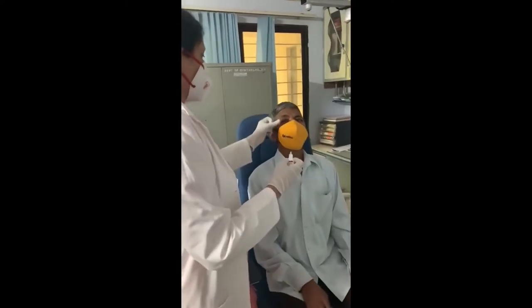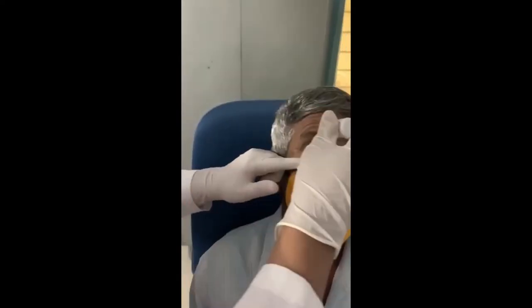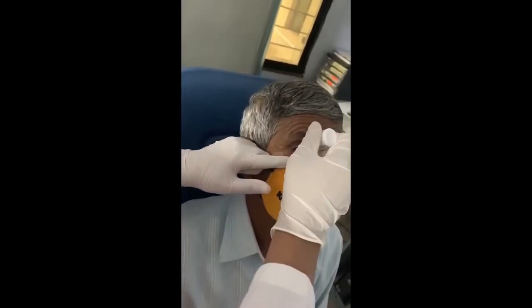After explaining the procedure to the patient, two drops of proparacaine are instilled into the eye and the patient is positioned comfortably on the slit lamp. Hold the eyelids apart and start scraping. Take the scraped material from the edge and the base of the ulcer. Keep the blade perpendicular to the cornea so as to avoid going deep into the corneal stroma.